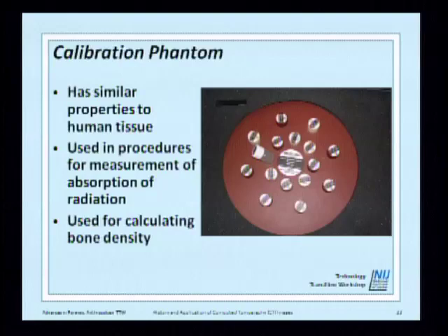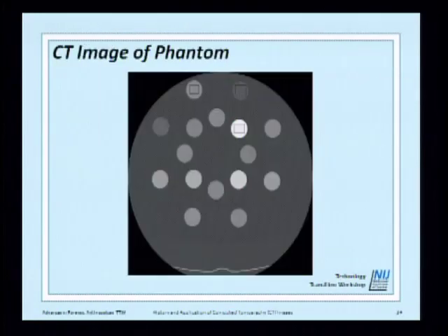And what we did initially, we used this Phantom for something completely different. It was not an anthropology application, but was more about knowing the material and bone density properties of some of the scans. And we put it with the same scan that we do with the specimen or the patient. So basically, we scan at the same time. And as you can see, the three outlined here, you have the cortical bone, and then the trabecular bone and another kind of material.